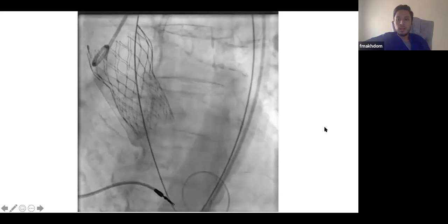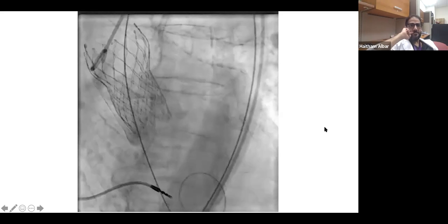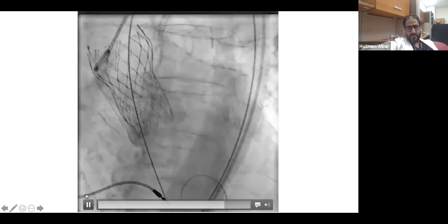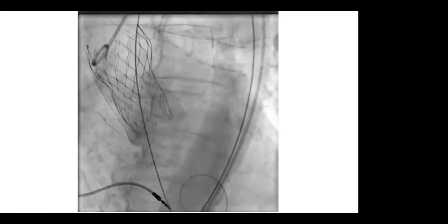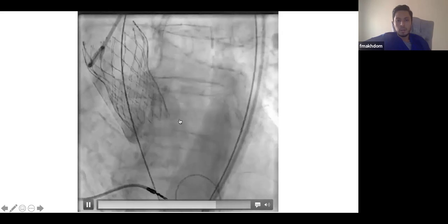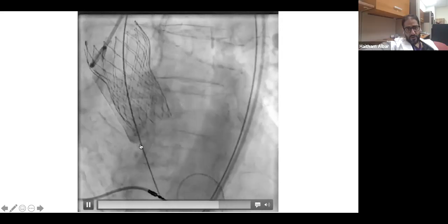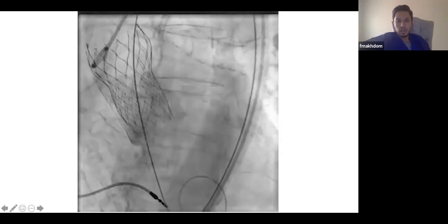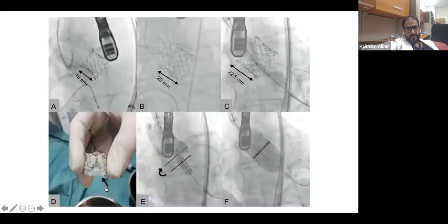Hussein, do you see it, Hussein? Yes, yes. I think this one is a good one. What do you think, Hussein? Maybe the internet is better on your side, but I think this is better. This one is also high. Yeah, it's high. Here maybe it's not very clear on your side. The non-coronary cusp. Yes, now it's clear. Oh yes, it is high. So they're both high.